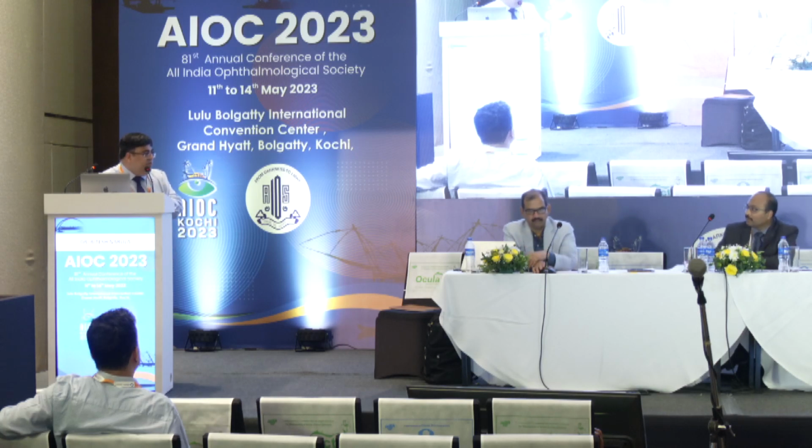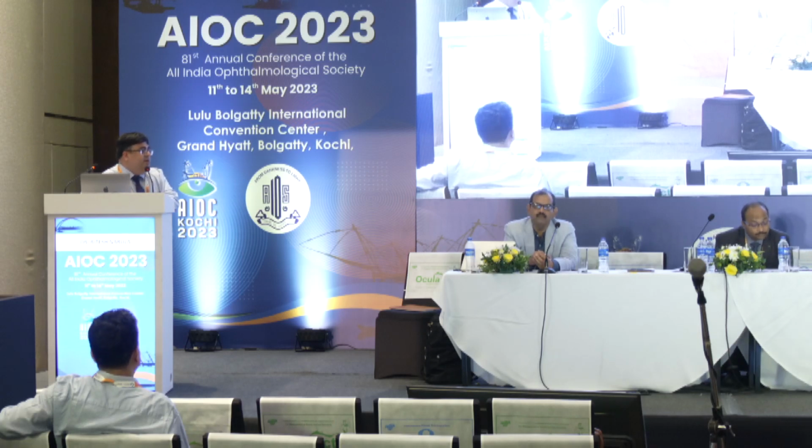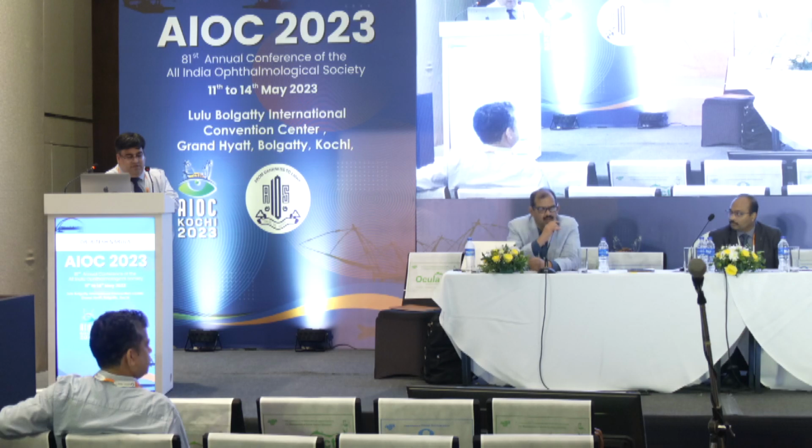Spectralis works beautifully with depth again, either Spectralis or Topcon, which allows you to go deeper. With us, we keep our Spectralis more for FA ICG. We don't let it be used for OCT angio that much. So as I said, it depends on what you are using. Do you have the Heidelberg system also at your place? Yes, we have. As I said, Heidelberg OCT angio we are not using that much because that machine mainly runs for doing our FAICGs. So Puneet, will you like to add something about Heidelberg?